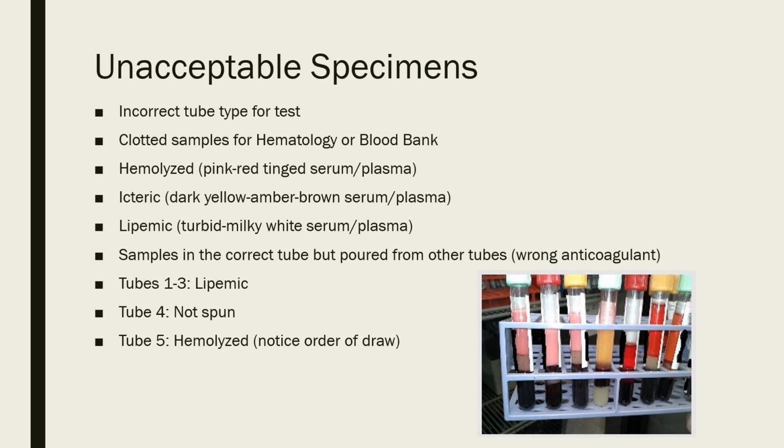So when you're trying to do a count on the number of red cells or platelets or white blood cells in a specimen, if they're half contained inside of that clot, then you're not getting an accurate number. So if you suspect that there's a clot in that tube and you check it, there is a clot in it, then you're going to have to ask for a new specimen.